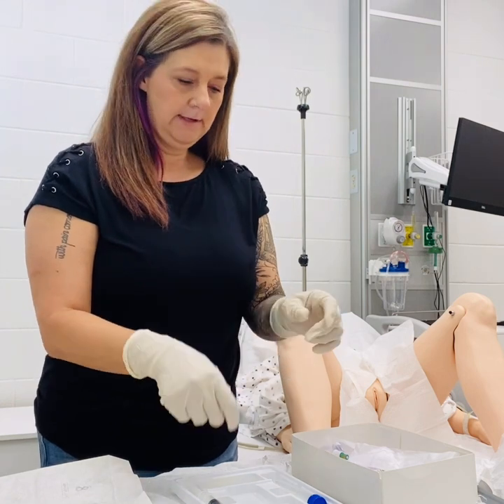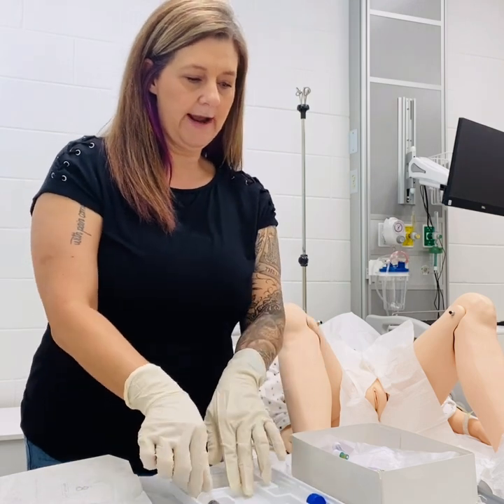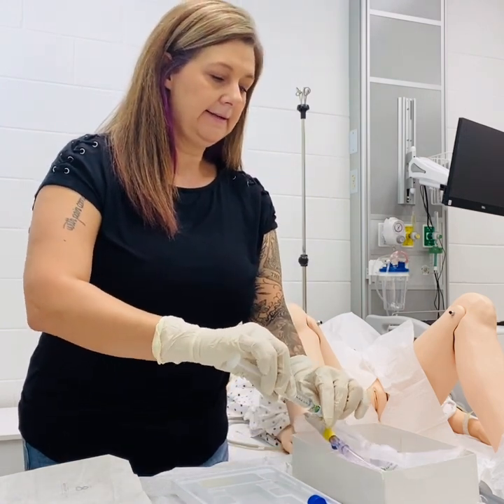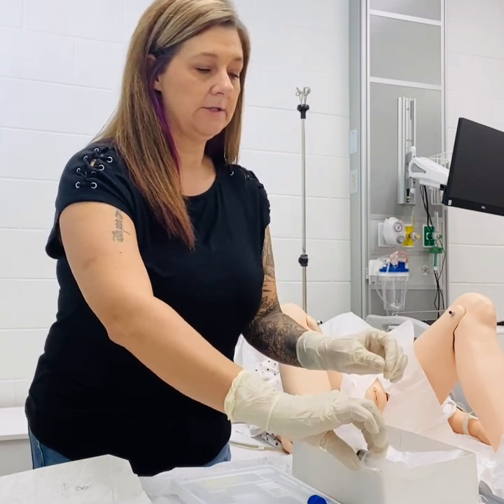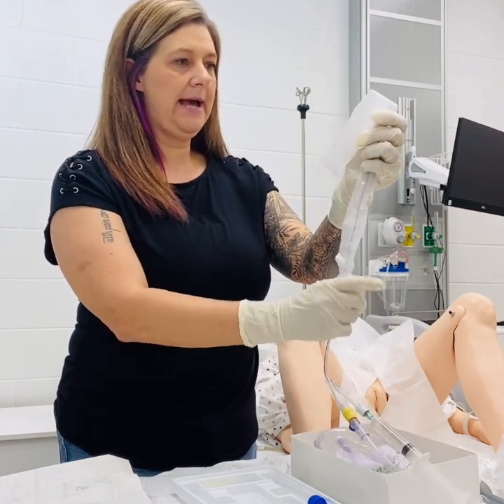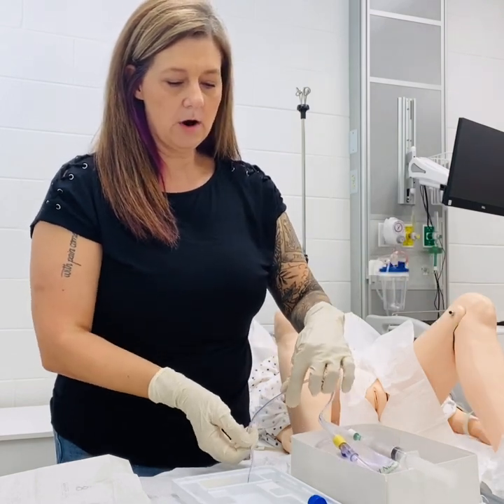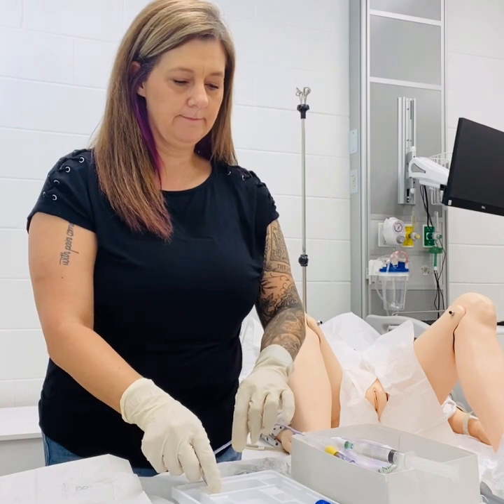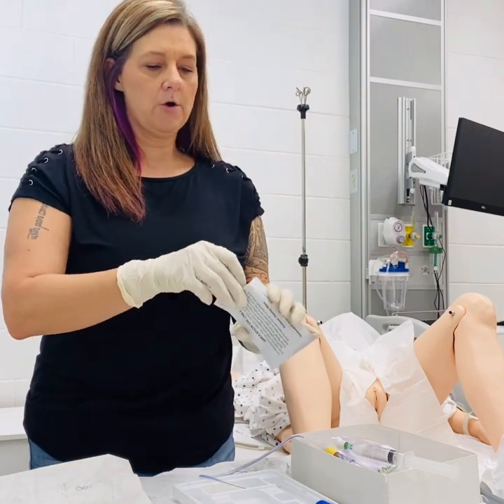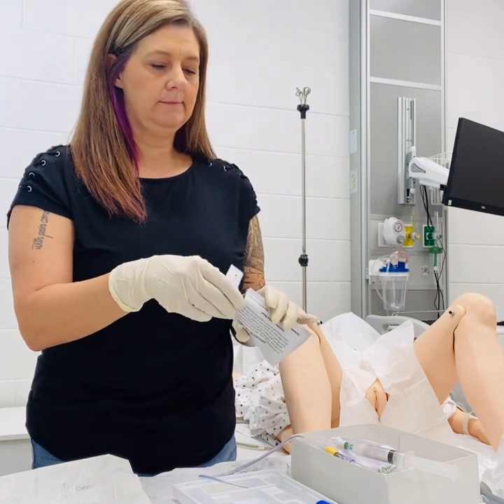I'm going to go ahead and open my lubrication and spray that in the tray so that I can insert the tip of the catheter in there. I'm going to open my sterile saline and connect that so it is also ready to use when I need it. We'll take the tip of our catheter out of the packaging and lay that in our lubrication. I'll open my swab sticks — there are three — and have those ready for cleaning as well.